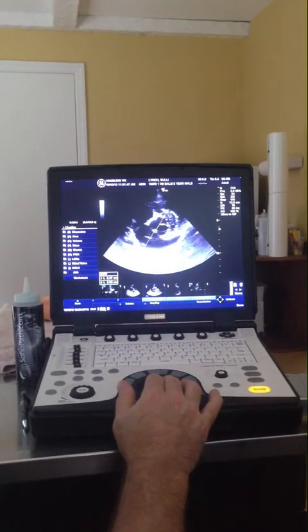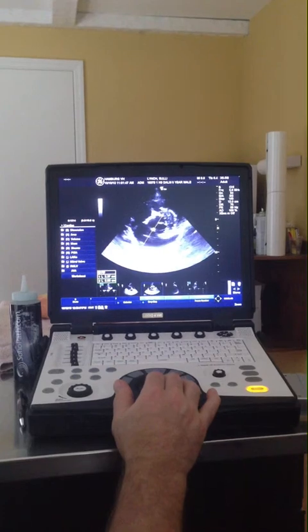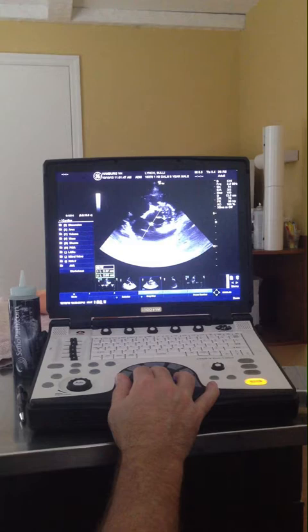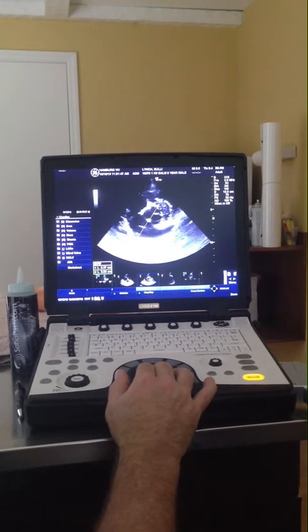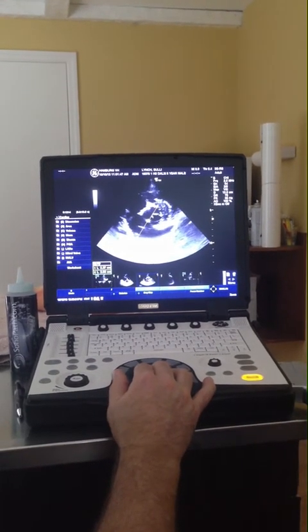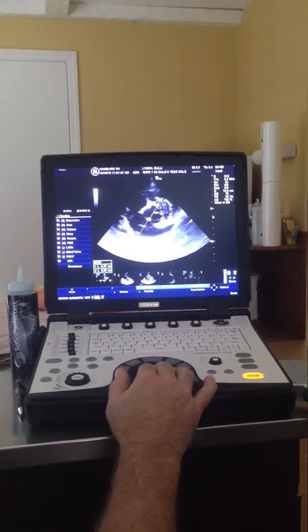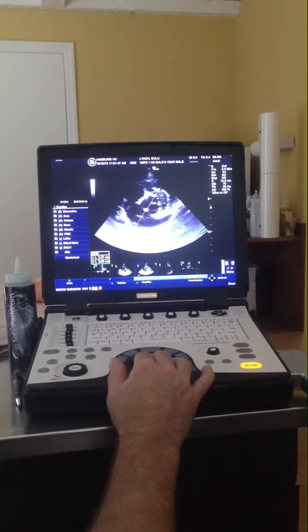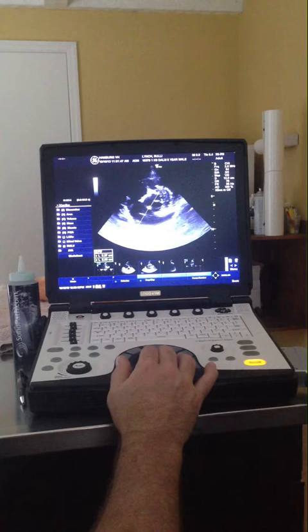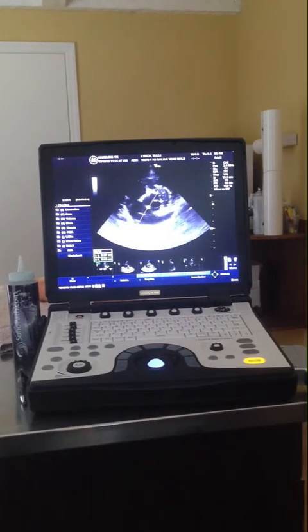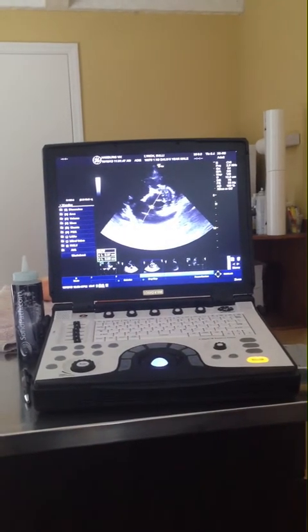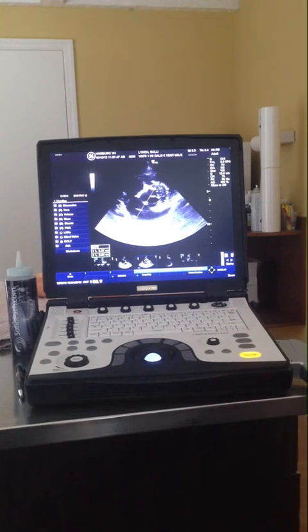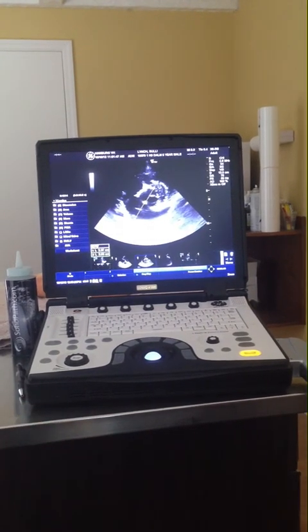For LA to AO in the heart base view, we try to get the three valves of the Mercedes-Benz sign in line at the heart base. We measure the internal diameter of the aorta, internal edge to internal edge, along with the internal edge to internal edge of the left atrium — LA to AO heart base. Those are the basic measurements we do in M-mode and B-mode that we report and follow up on as the pathology progresses.